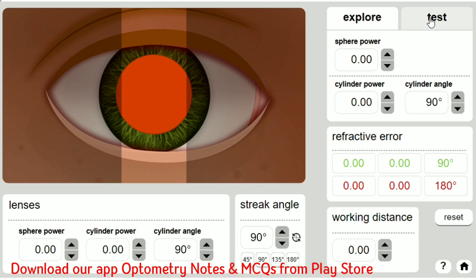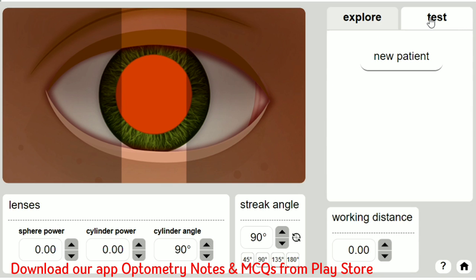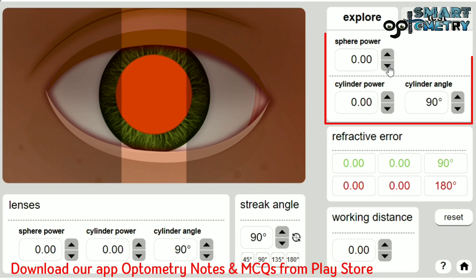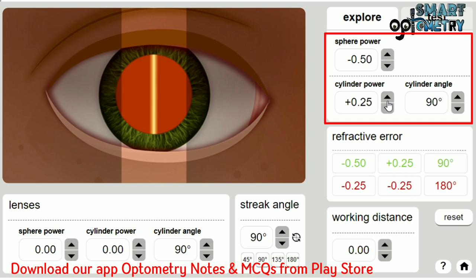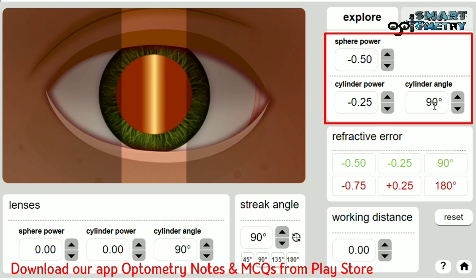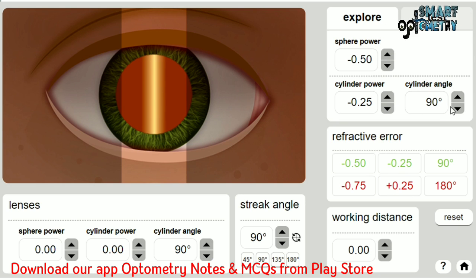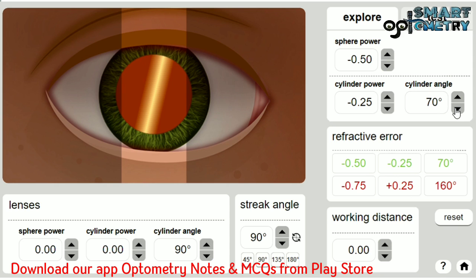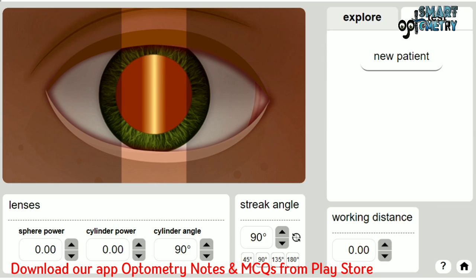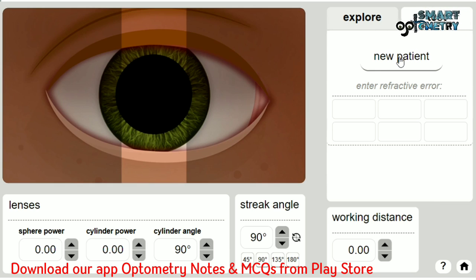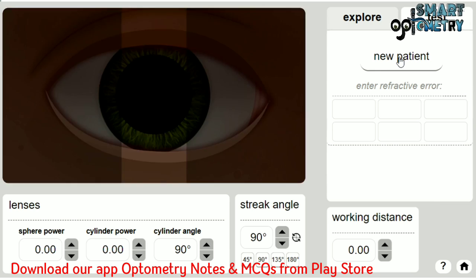Two interfaces are available: one is 'Explore' and another is 'Test'. In explore mode, you can enter the refractive error manually and neutralize this refractive error using trial lenses. In test mode, they will give you a patient and you won't be able to know the refractive error — you have to identify it.